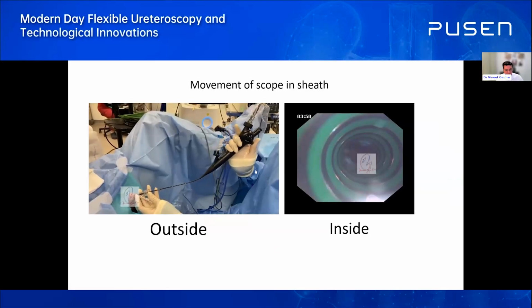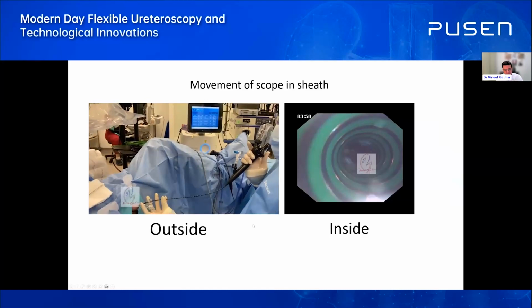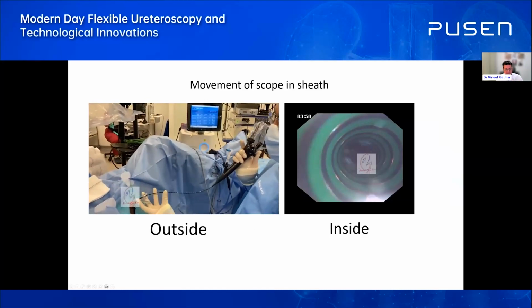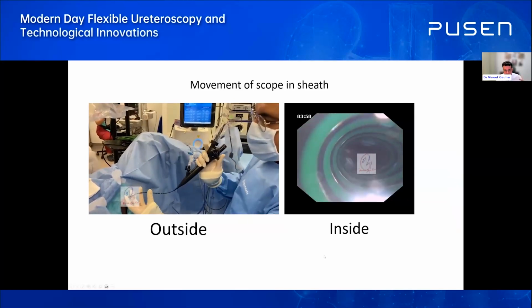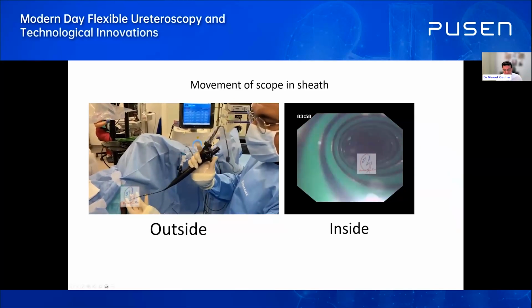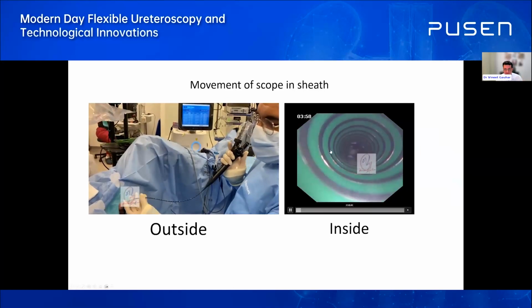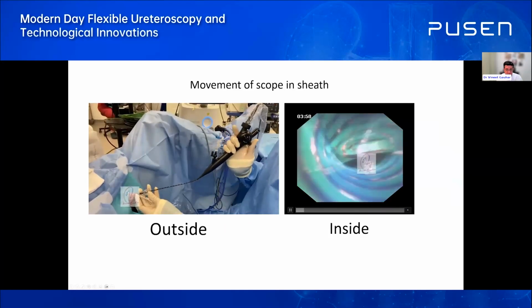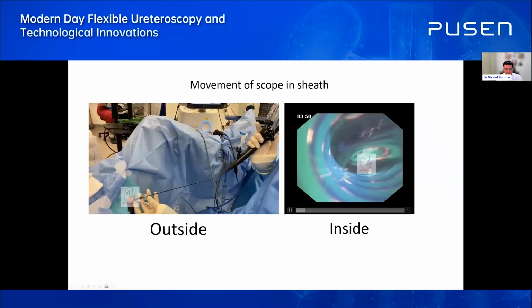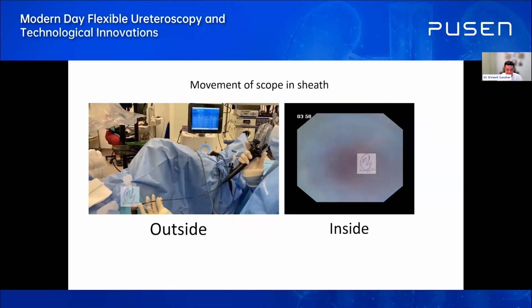Now, this is a practical part where you have to learn to maneuver the scope in and out of your sheath, which is why I said you really need a good quality sheath. And that's how it's going to look inside when you're coiling and moving through the sheath. As you move through, you'll be seeing how your scope is going through. Now, this inside hydrophilic coating, in the Cleopatra and a couple of other sheaths that I've used, is fantastic. They've managed to really improve the way the scope slides through.